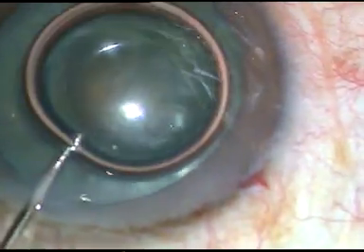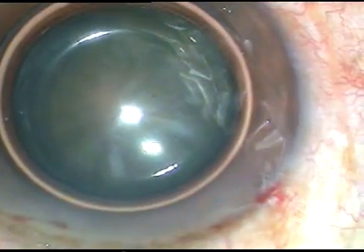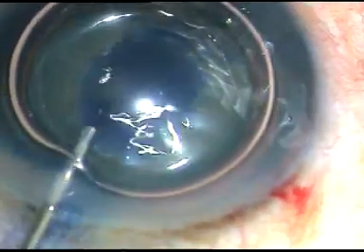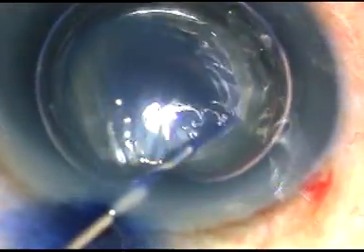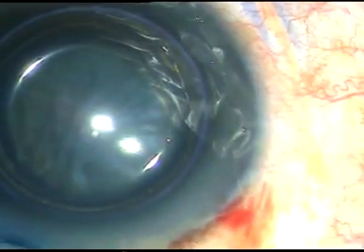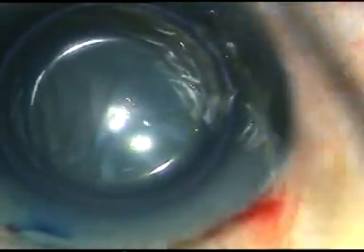Now, this is a big air bubble. And underneath this air bubble, I am injecting trypan blue dye, 0.06%. I don't wait for a long time — after 5-6 seconds, I wash the dye out of the anterior chamber.